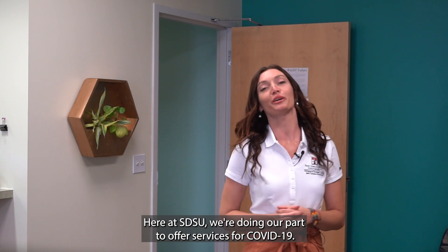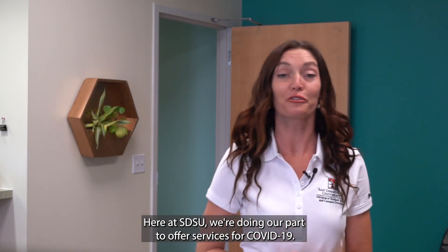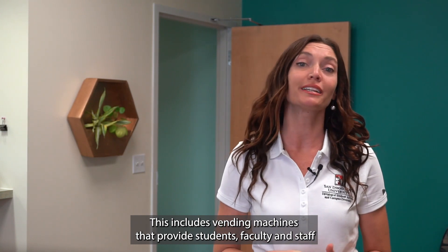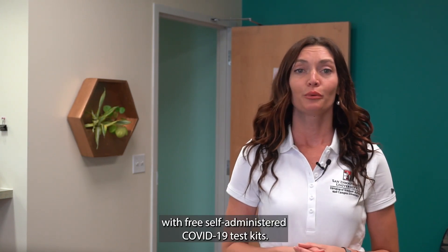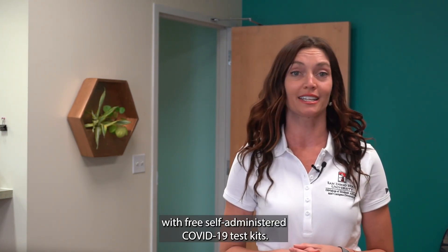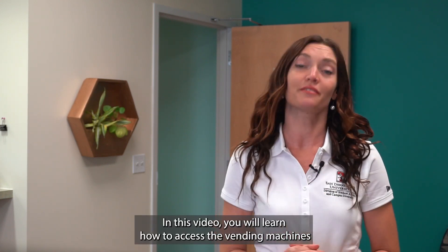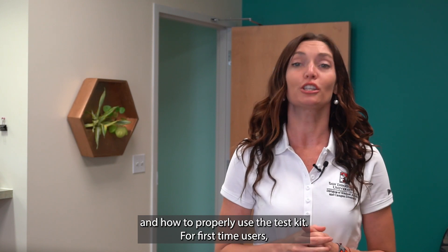Here at SDSU we're doing our part to offer services for COVID-19. This includes vending machines that provide students, faculty, and staff with free self-administered COVID-19 test kits. In this video you will learn how to access the vending machines and how to properly use the test kit.